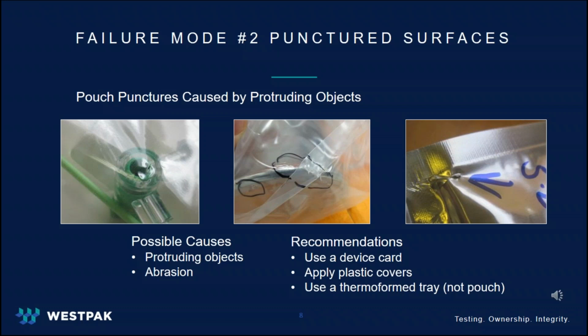The second failure mode is punctured surfaces caused by protruding objects. We've seen a lot of failures from sharp objects poking through trays and pouches. Also, abrasion due to objects rubbing against the pouch or tray during vibration creates a hole in the SBS.